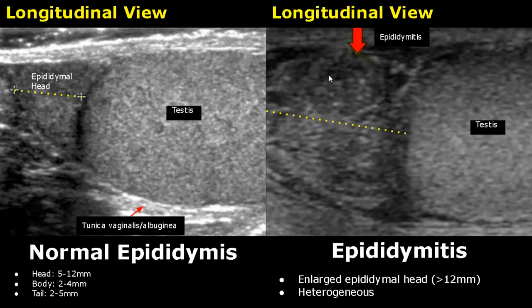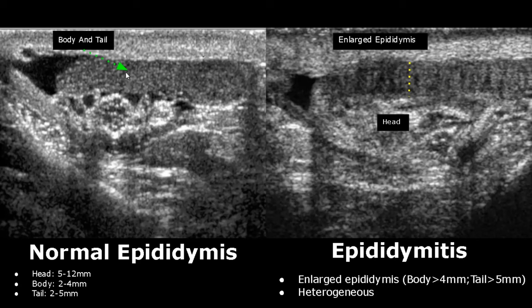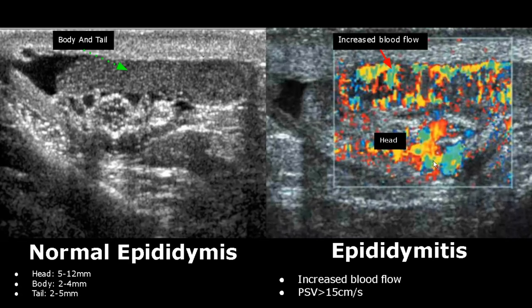Epididymitis is the inflammation of the epididymis. Here the head is enlarged and also heterogeneous. In these images we can see the body and tail of the epididymis — in epididymitis the body and tail are heterogeneous as compared to the normal images. On color Doppler there is increased blood flow due to inflammation, and the peak systolic velocity (PSV) will be more than 15 centimeters per second.